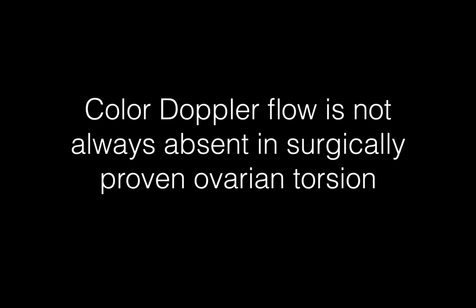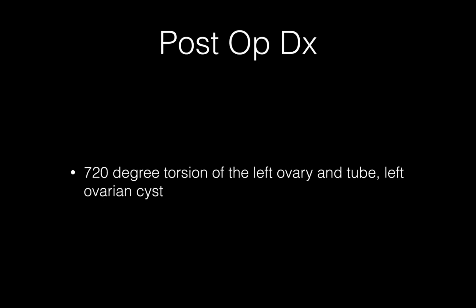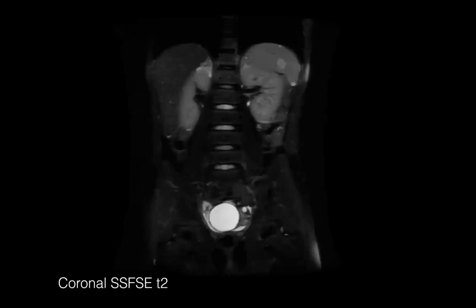Shreyas, are we able to see the twist from MRI? You can see it on post-contrast images sometimes. The clue is really more that the ovary is sort of sitting in the center. Usually it's off to one side. So when it gets twisted and you see it move to the middle, that's a sign that it's twisted. But usually it's not so easy to see the twist itself directly. Okay, thanks.